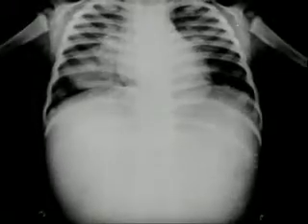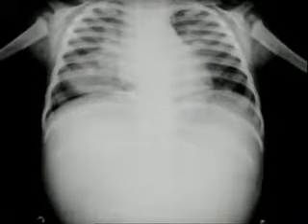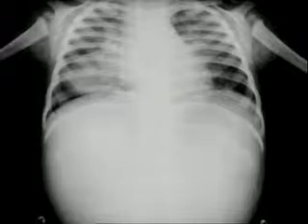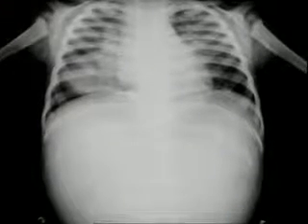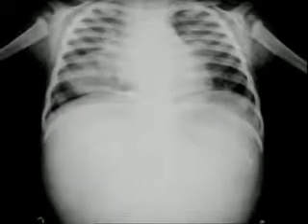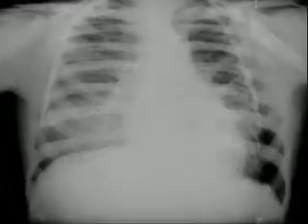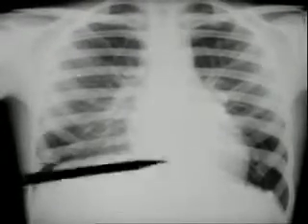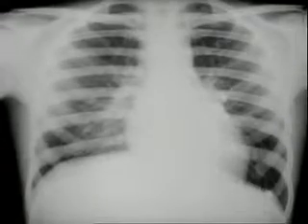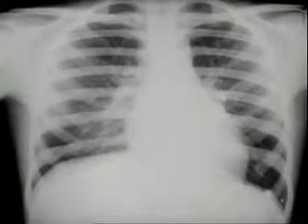To illustrate first infection forms of tuberculosis, we have here a primary bronchopneumonia in a child of 6 months that was nursed by a maid who flatly denied any subjective symptoms, but who showed extensive pulmonary disease by the X-ray. This film of another primary complex shows the pulmonary component, the Ghon focus, and the lymph glandular hilar shadow in a child of 3 years.